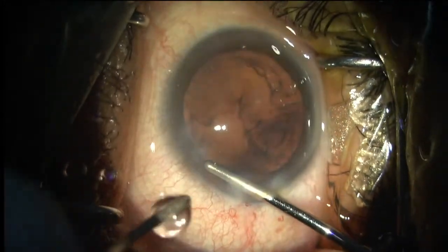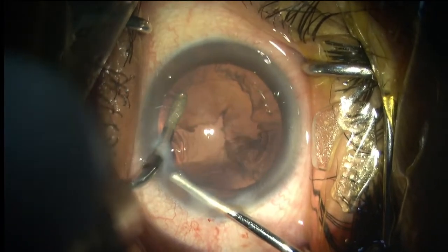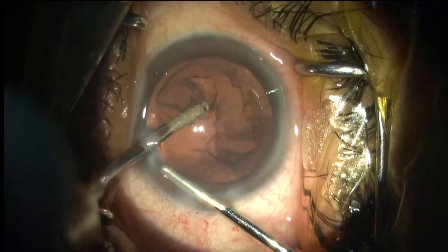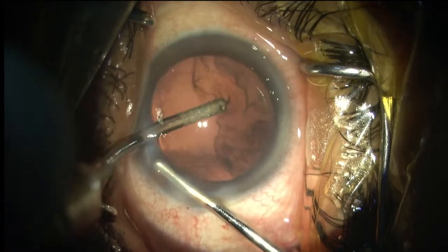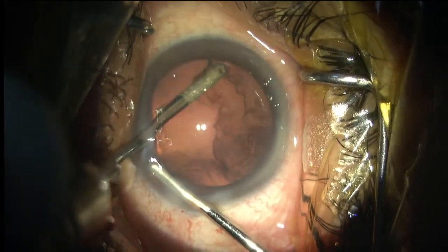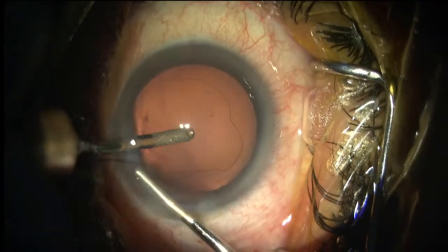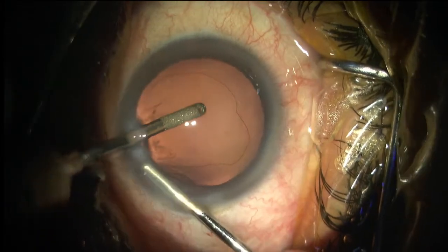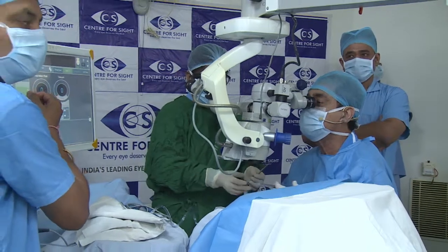So now you can see I keep the cannula slightly tilted, so there is no leakage in spite of the cannula being very thin. So I don't have to make a second side port. So still I get the advantage of the bimanual, but it has to be a continuous mode. So now I'll put on a viscoelastic again before I withdraw my infusion.